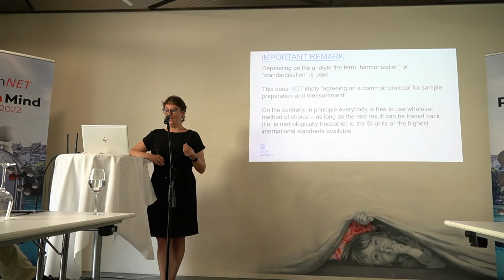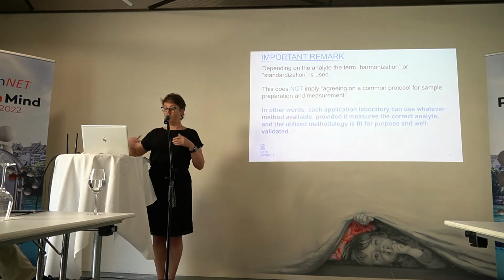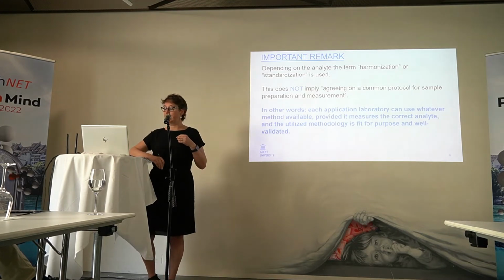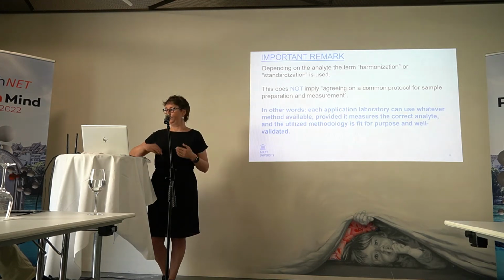It absolutely doesn't mean that everybody from now on has to do exactly the same. No, on the contrary, the principle is really very clear. Everybody is free to use whatever method of choice, as long as the end result can be traced back, is metrologically traceable to the SI units or the highest international standard available. So that is something which is important, and in other words, it means that each application laboratory can use whatever method available, provided it measures the correct analyte and it utilizes a methodology which is fit for purpose and well validated. But that is the responsibility of the laboratory.